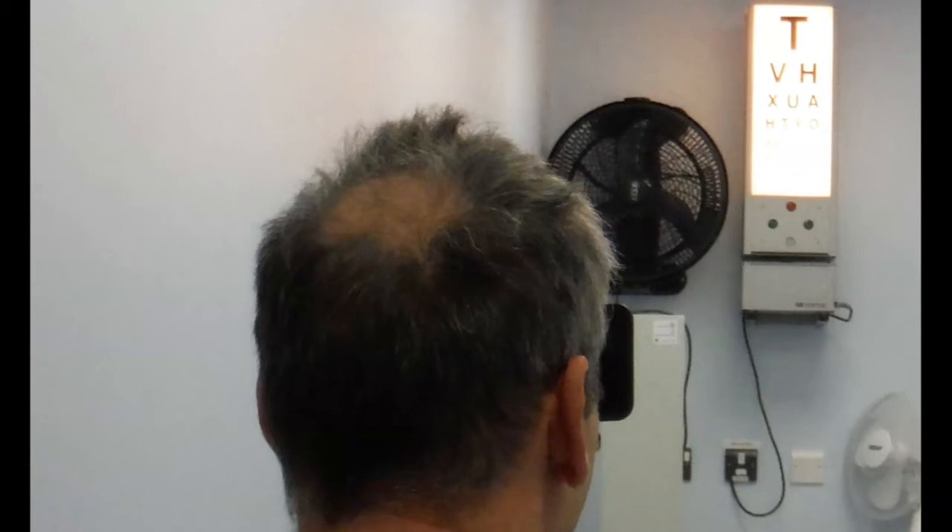Here is a patient whose right eye is being tested for visual acuity. You can see that the left eye is completely occluded with this proprietary occluder, but a piece of card is equally effective. The patient can hold the occluder himself and sits at six meters or twenty feet from a Snellen chart, and is instructed to read as far down the chart as he possibly can. You should use gentle encouragement to really test them to the limits of their ability to see.